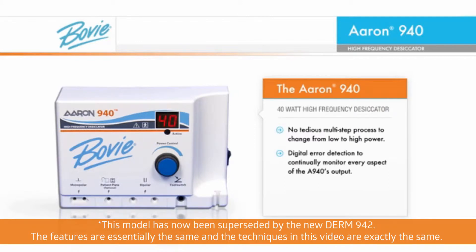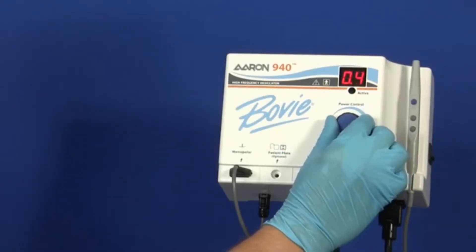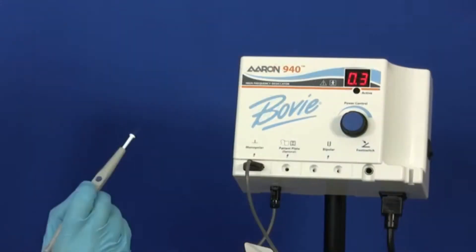This generator has digital error detection and continually monitors every aspect of the A940's output. It allows doctors to change power settings with one action using the rotary power control dial or the up-down buttons on the autoclavable handpiece.